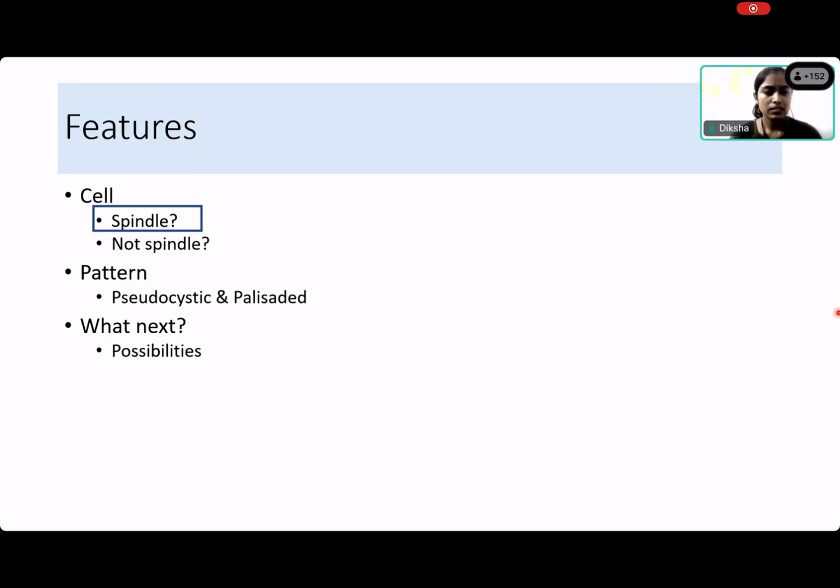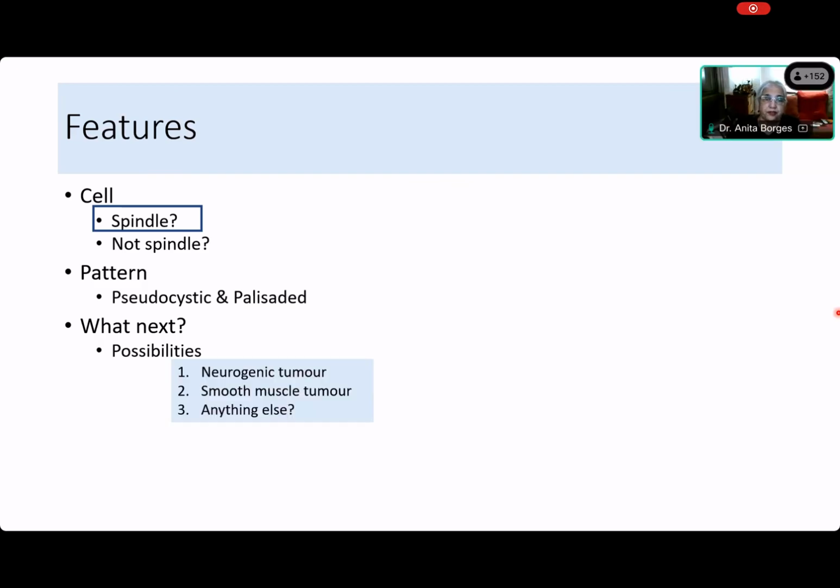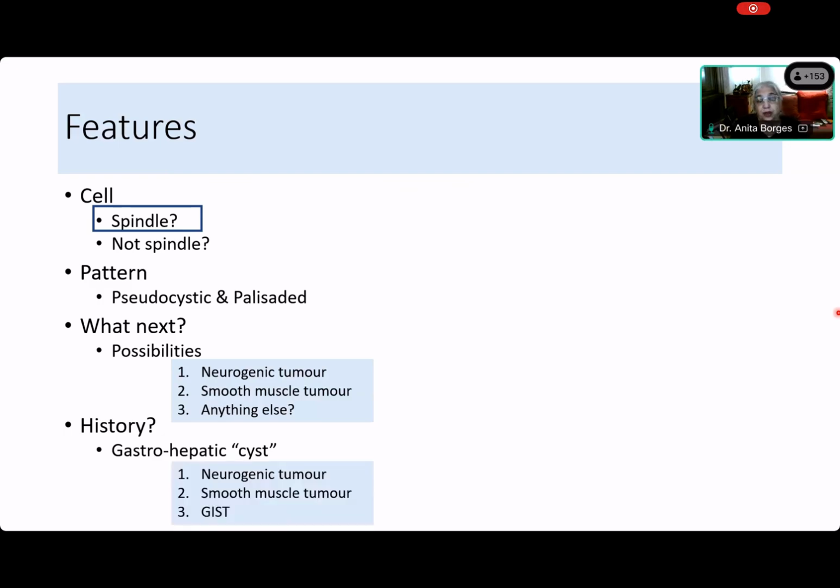Ma'am, considering the stain, I'm thinking about a gastrointestinal stromal tumor. Very good, Diksha. See, you have three: a neurogenic tumor, a smooth muscle tumor, and something else. I'm happy that you thought of a gastrointestinal stromal tumor, because if you look at the history, what neurogenic tumor is going to form a cyst in the gastrohepatic ligament? Yes, there may be a smooth muscle tumor in the gastrohepatic ligament, but when the history tells you that there is a gastrohepatic cyst, then something else has to come into the differential diagnosis, and that is what you just said, which is very good, a gastrointestinal stromal tumor.